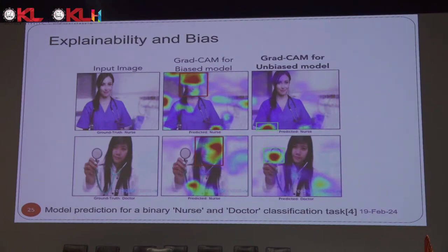We expected the model to be looking at whether the person has a stethoscope or a half sleeve, but the predictions are right, accuracy is good. But this is what we call explainability. There is a technique called GradCam visualization. This will help us identify if there is any bias in the network.